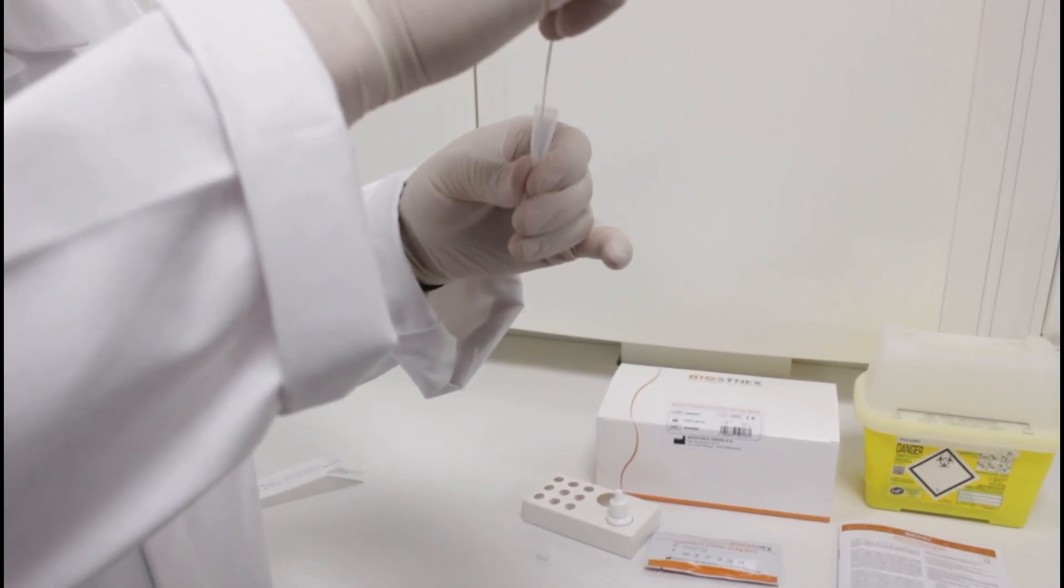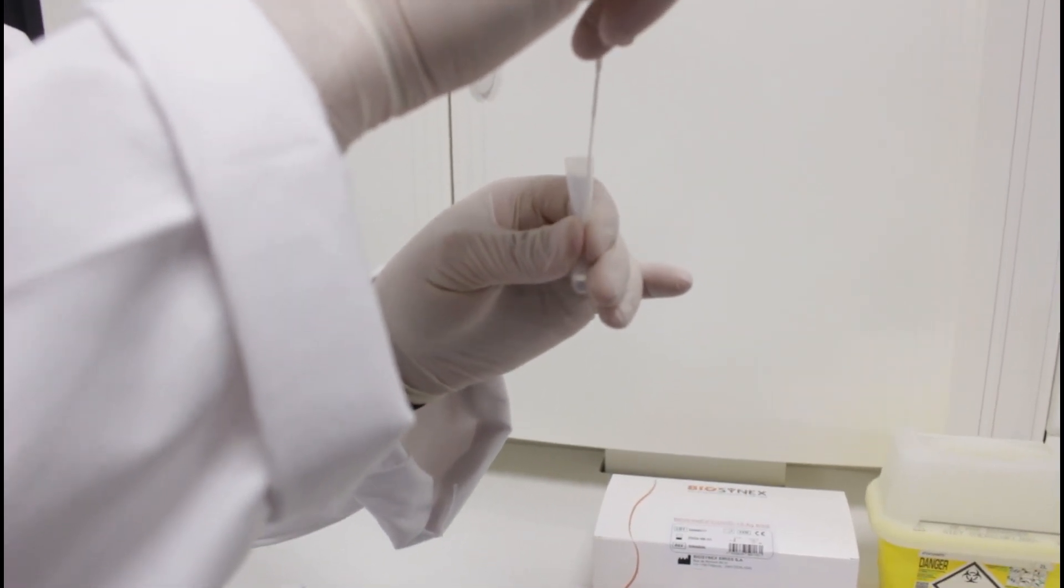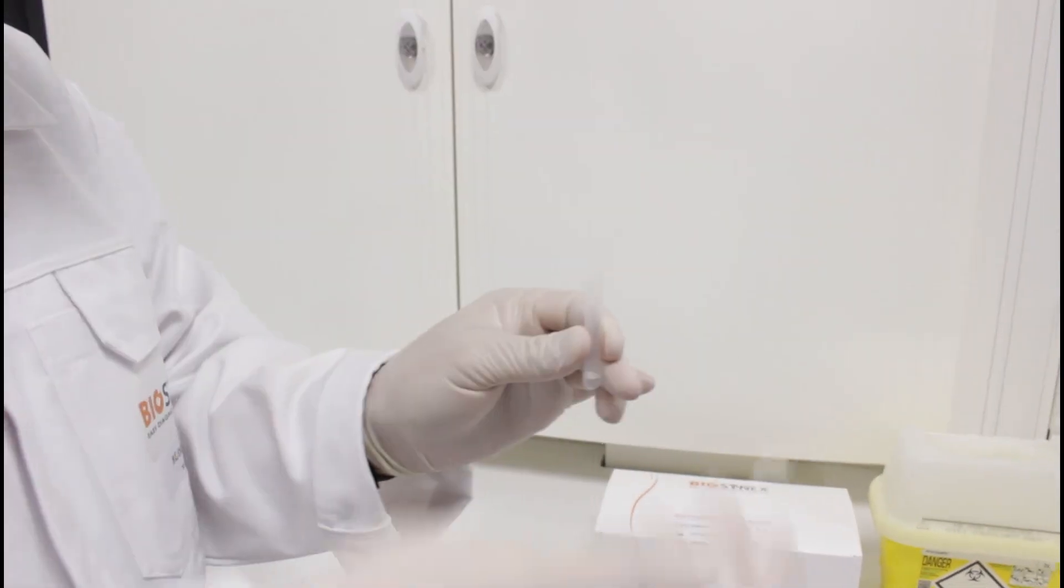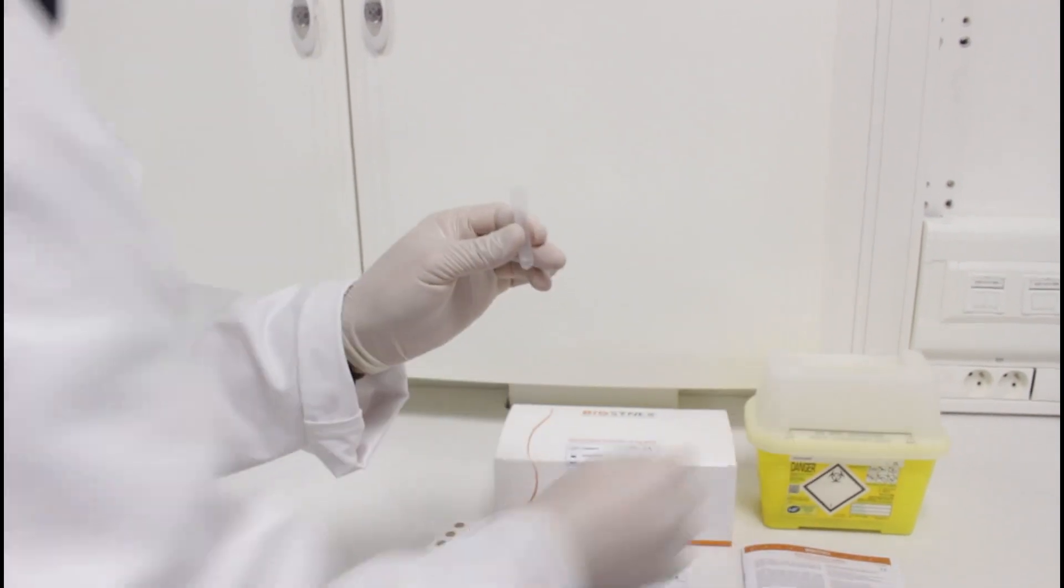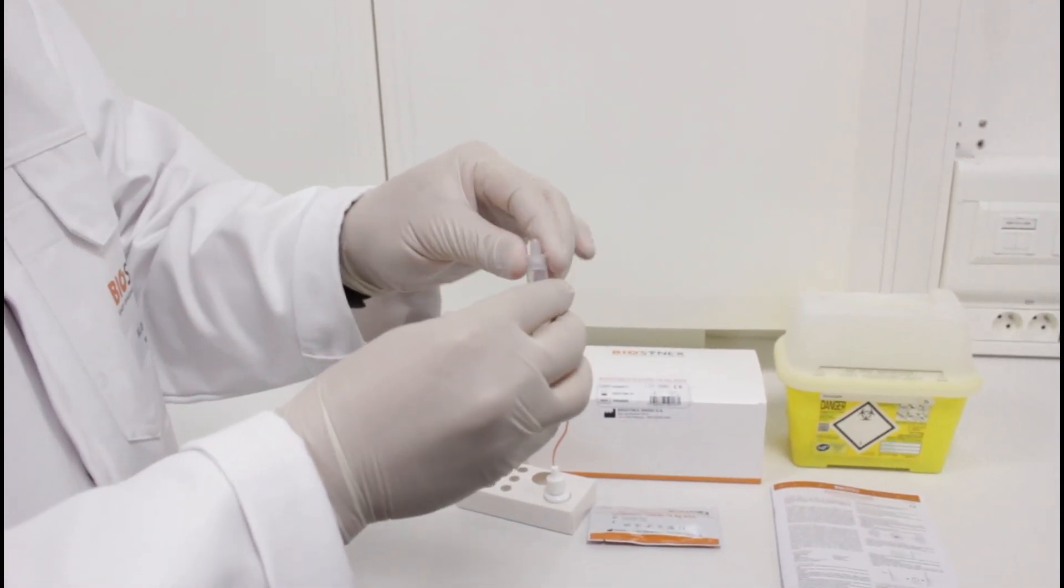To remove the sample swab, squeeze the tube several times to fully extract the sample from the swab. Then place the swab in a yellow bin. The extraction solution will be used as the test sample.